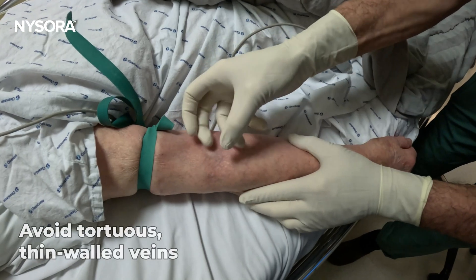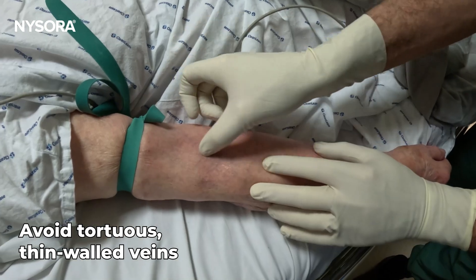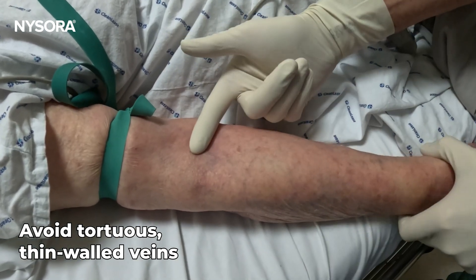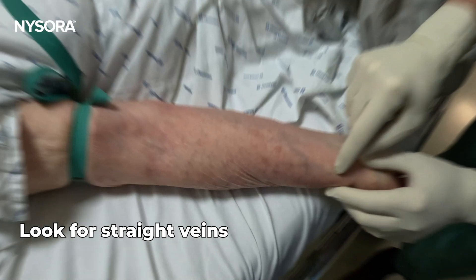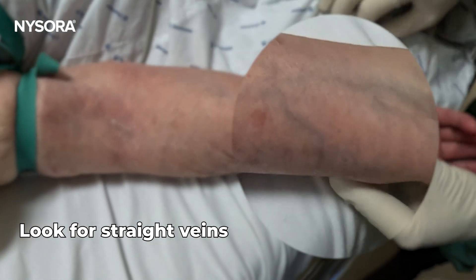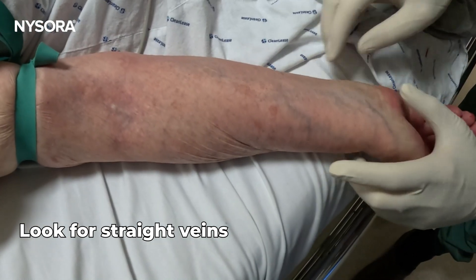Tip number two: avoid tortuous thin-walled veins, especially those near the elbow, as they can easily kink. Instead, look for straight veins with few tributaries that help anchor the vein during cannulation.